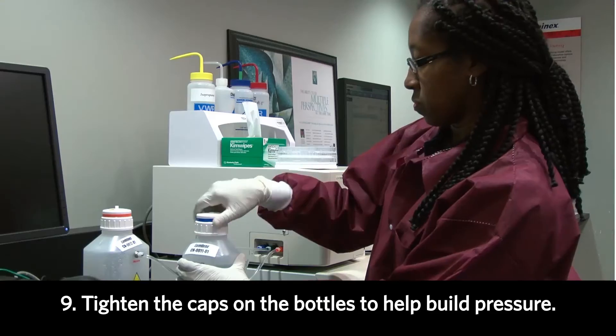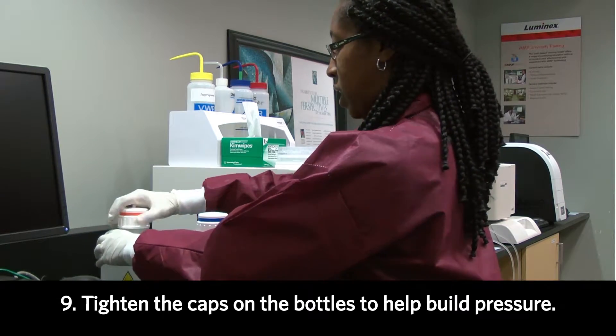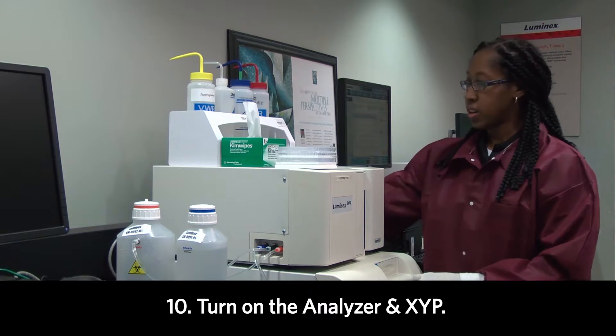Now, be sure to tighten the cap on the bottles and this will help pressure build. Now, turn on the analyzer and the XYP.